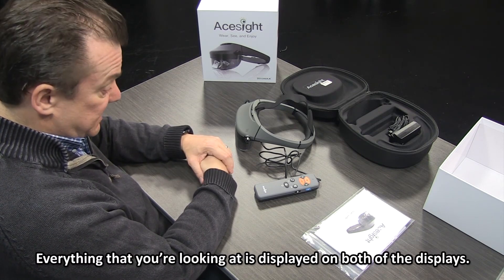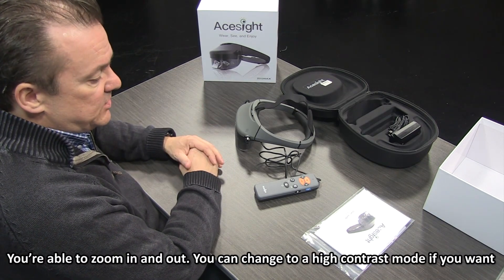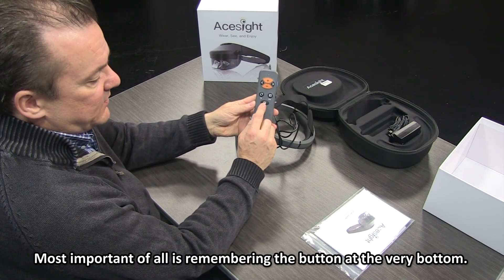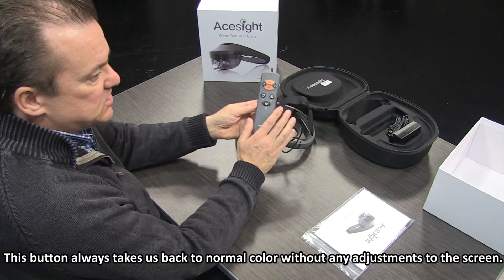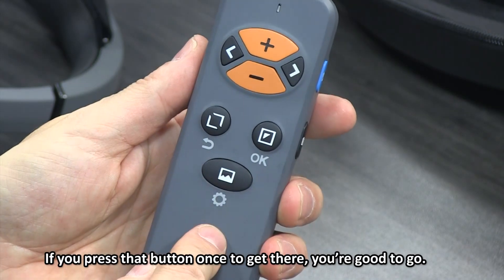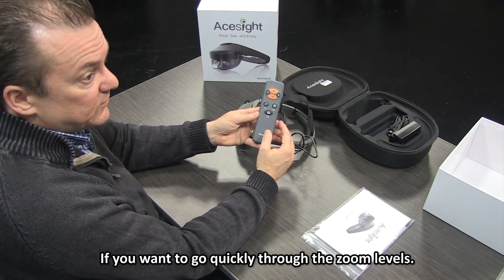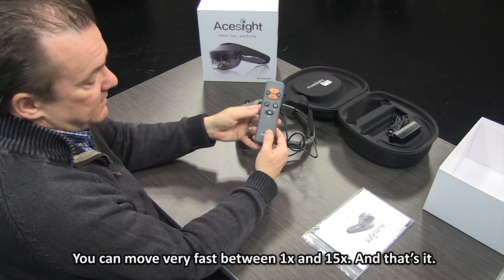Everything you're looking at is displayed on both displays, mirroring the image for each eye. You're able to zoom in and out, and you can change to a high contrast mode. Most important of all, the button at the very bottom always takes you back to normal color without any adjustments — no outlining, no high contrast, just normal color. Press that button once to get there. Zooming is just a plus and minus button; press or hold the plus button to go quickly between 1x and 15x zoom.